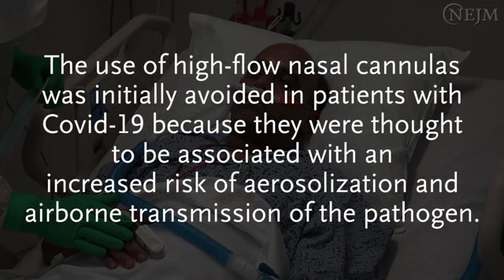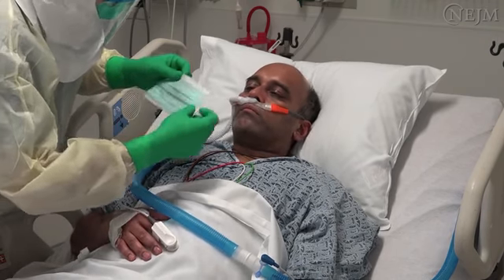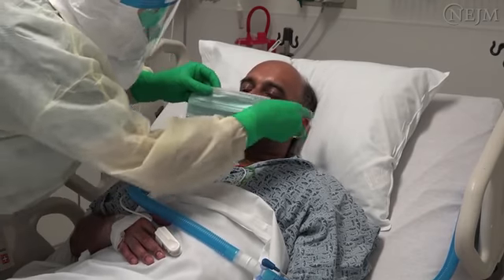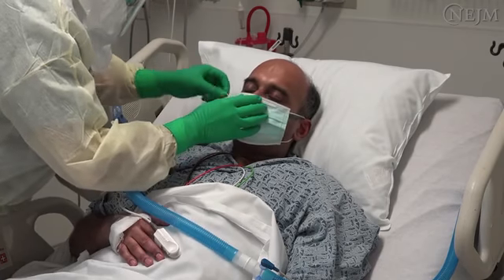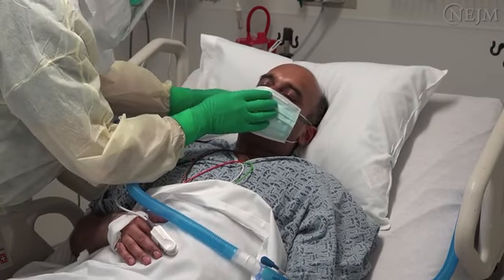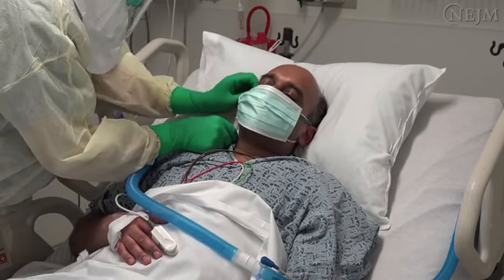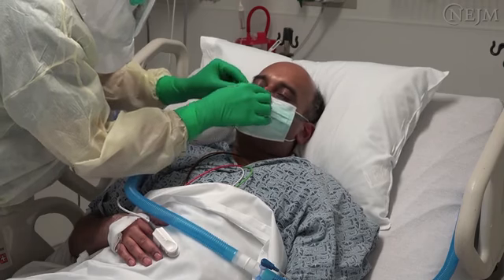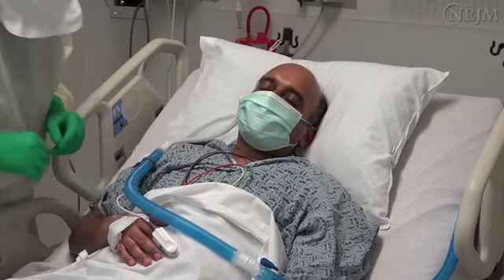The use of high-flow nasal cannulas was initially avoided in patients with COVID-19 because they were thought to be associated with an increased risk of aerosolization and airborne transmission of the pathogen. However, emerging data suggests that this device may be used in patients with less severe forms of COVID-19 pneumonia without posing major risks to healthcare providers as long as appropriate personal protective equipment is used and precautions against airborne transmission are taken. A surgical mask can be placed on the patient to reduce droplet deposition and the risk of particulate contamination.